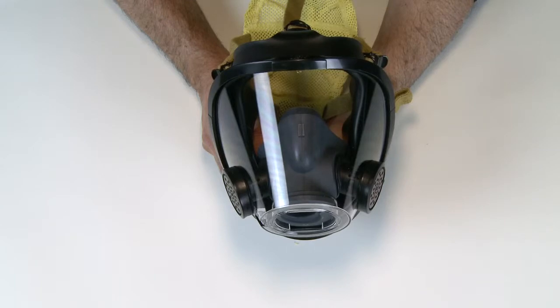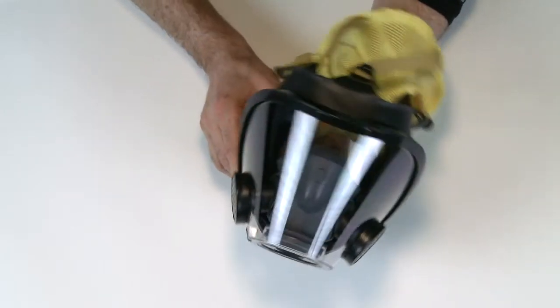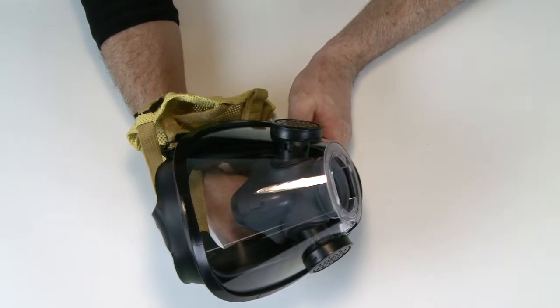On the outside of the facepiece, look at the lens. Make sure there are no cracks, gouges, scratches, or other conditions that may interfere with the operation of the facepiece. Make sure that nothing interferes with the wearer's vision.